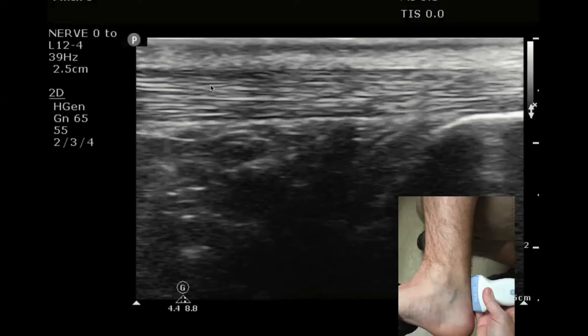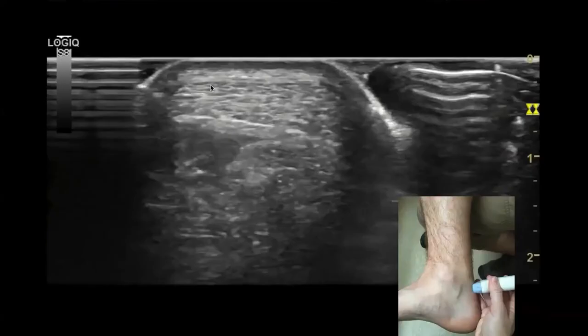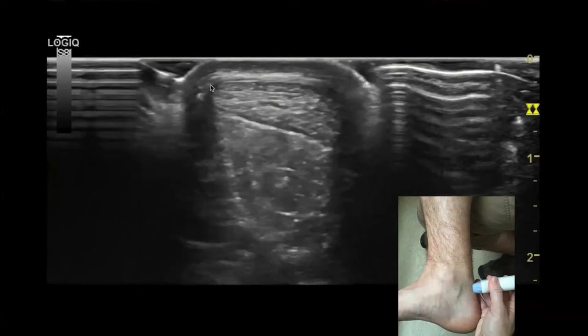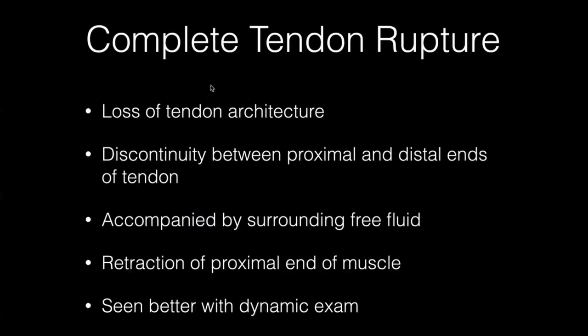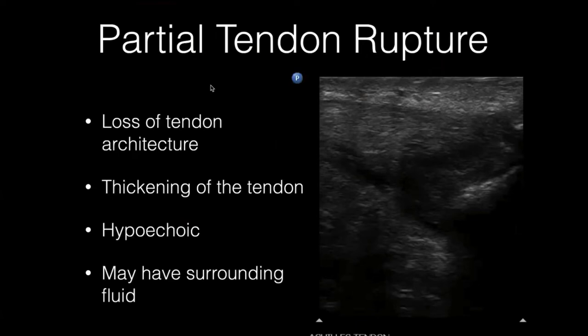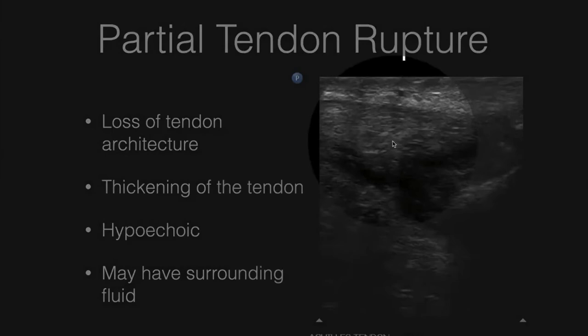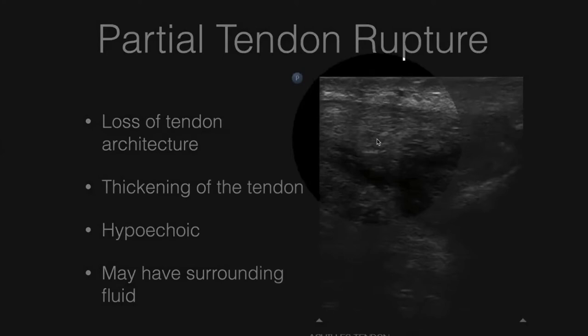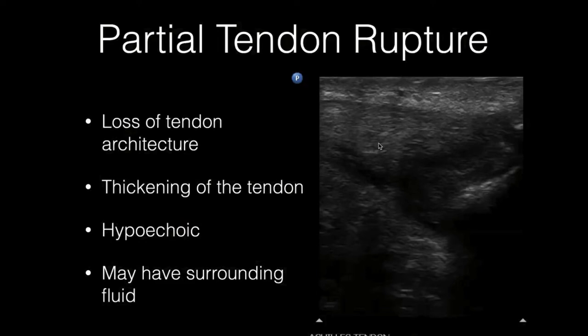The normal Achilles is a very thin tendon with very organized linear echotexture. In cross-section it's oval-shaped with consistent echotexture throughout. When injured, you see disruption of that architecture — loss of the fibrous appearance on either side of the injury site. Here's an example of a partial tendon rupture: a thickened tendon whose echotexture has changed, darker than normal, lost its fibrous appearance, looking like a big amorphous blob. Watch for surrounding fluid in that area as well.